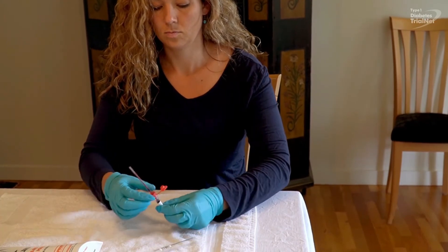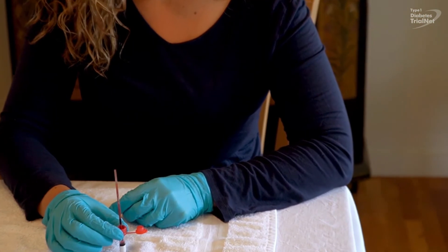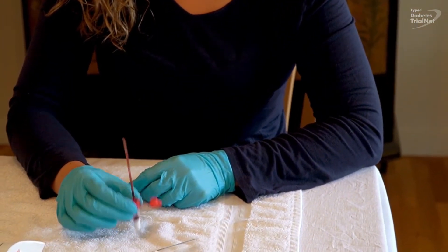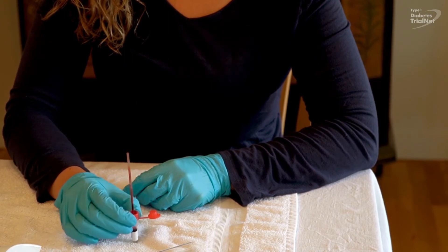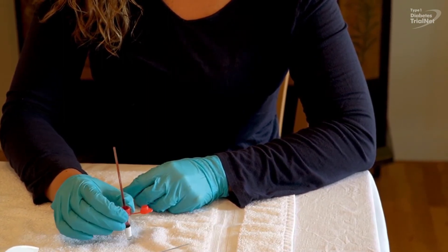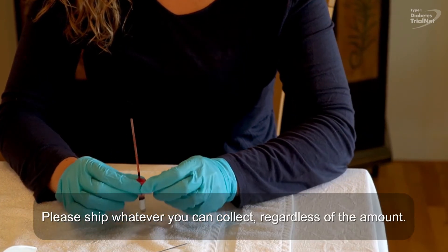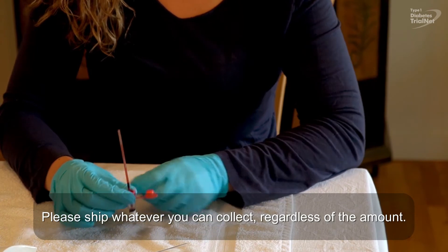When you are finished collecting the blood, stand the tube upright, and if you are using the straw, allow the remaining blood to flow down into the tube. You may need to give the tube a few gentle taps. If you are not able to collect the full amount, please feel free to try again with the second lancet. Please prepare and ship whatever you are able to collect, regardless of the amount.